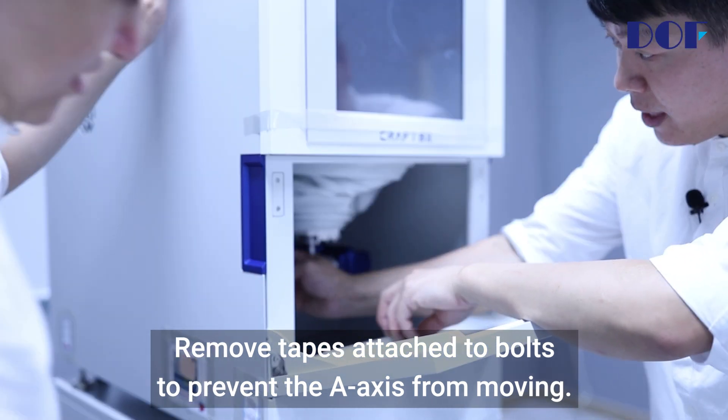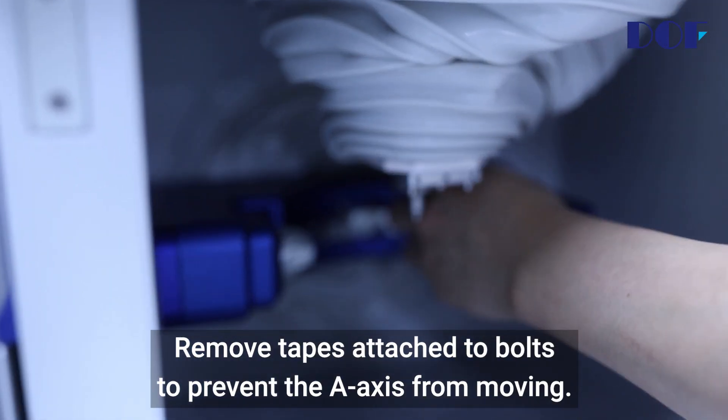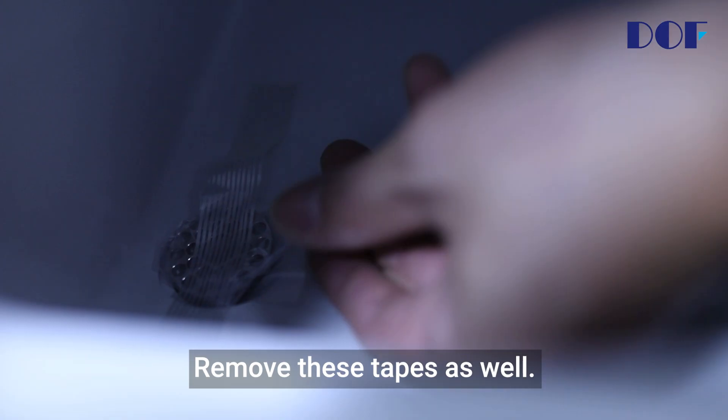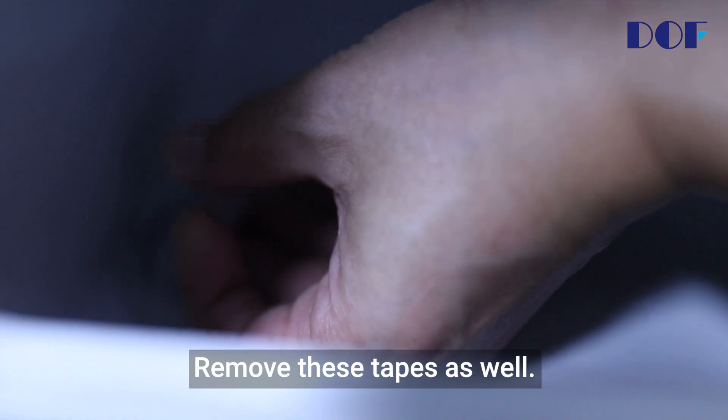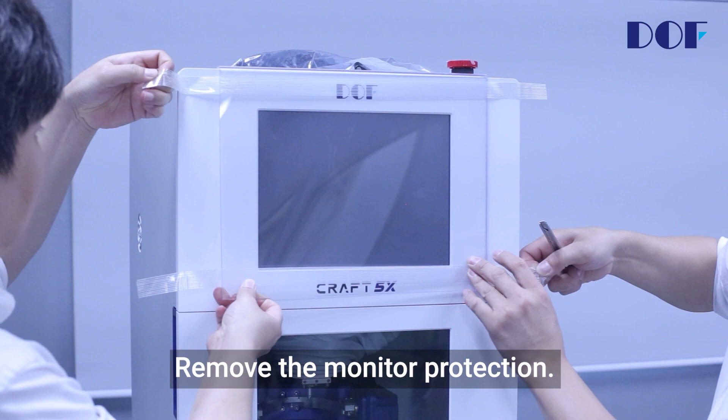Remove the tapes attached to bolts to prevent the A-axis from moving. Remove these tapes as well. Remove the monitor protection.